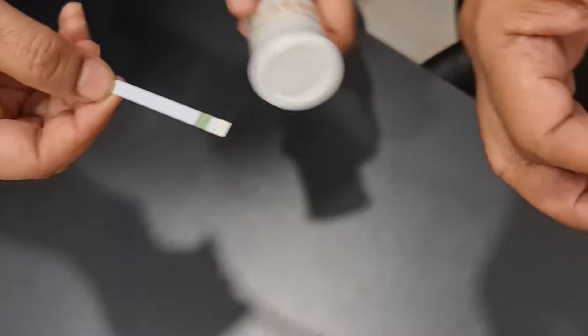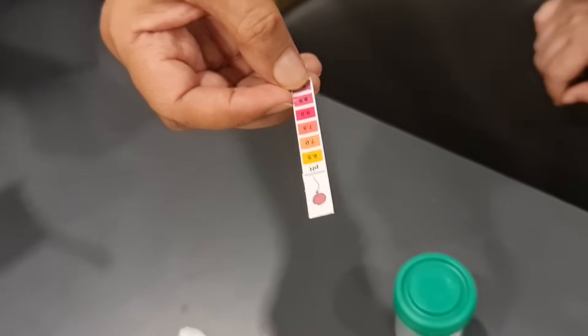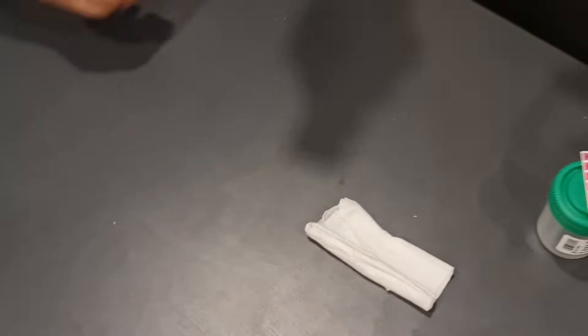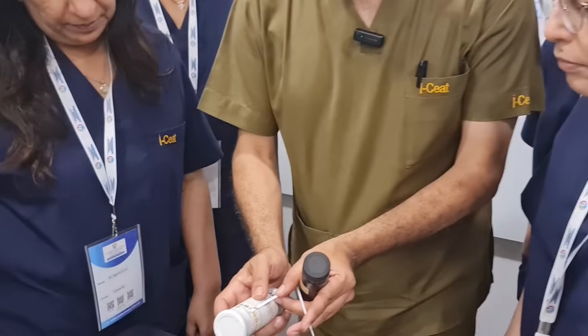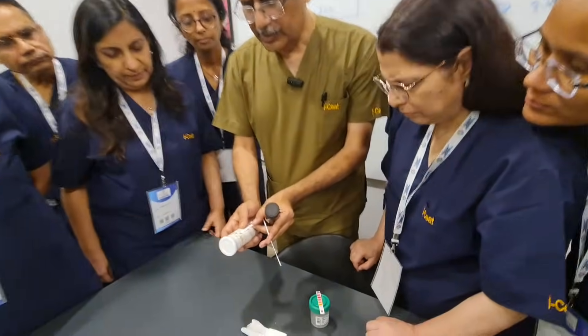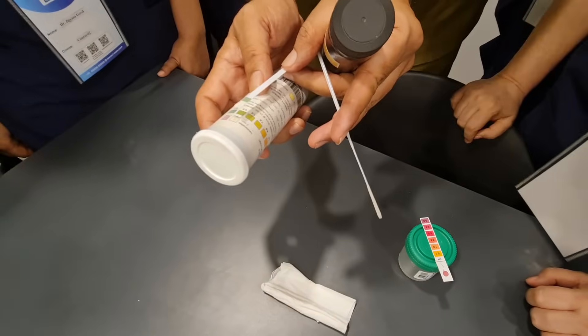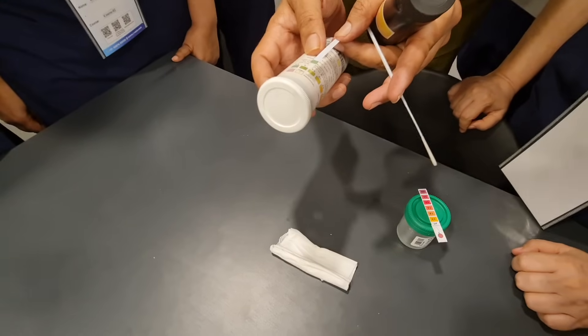We can have either a plain pH paper, which gives us just the pH color reading, or a different pH paper that gives us the leucocytes as well as the pH. Using the combination paper here, we can compare both results. The leucocytes are nil, and the pH is somewhere around 7.5 to 8.